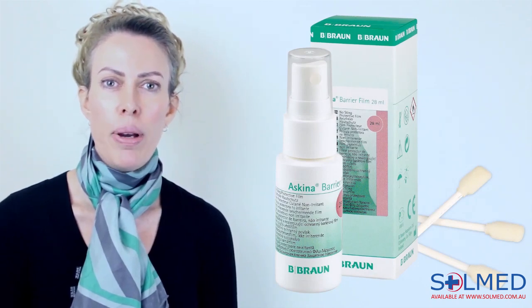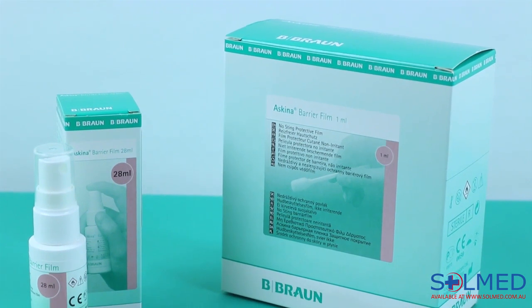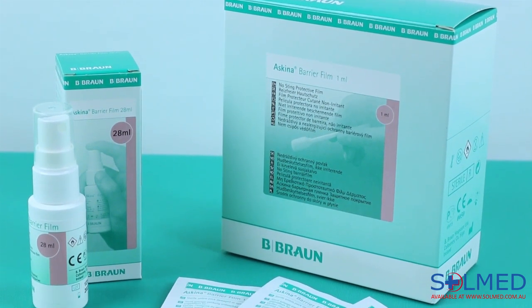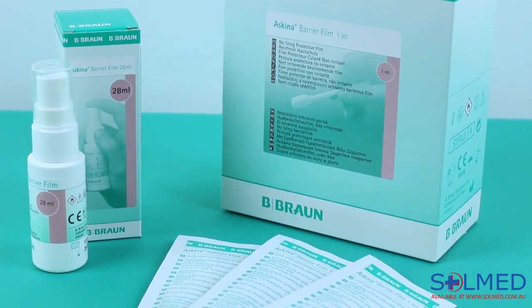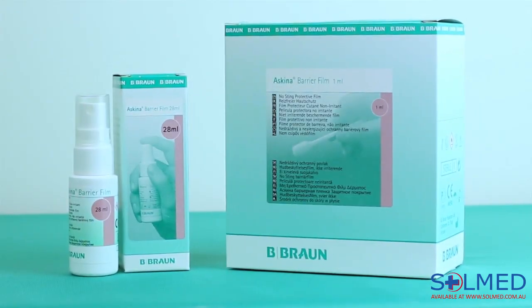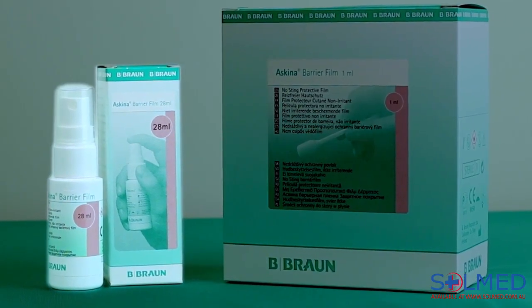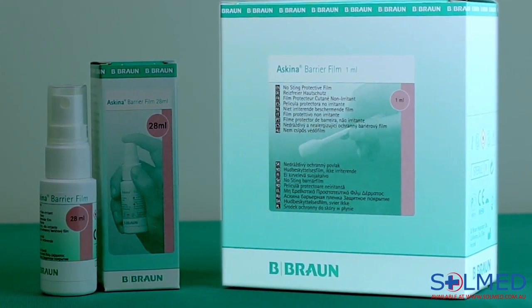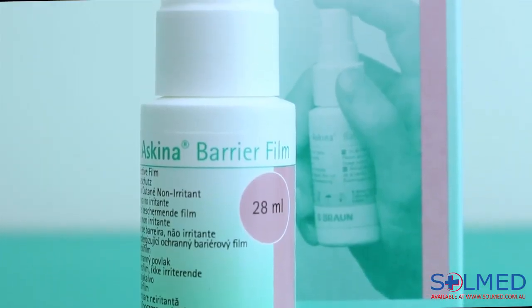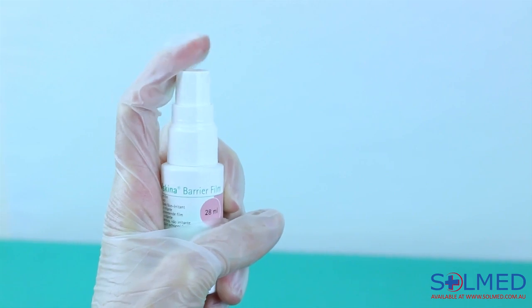This video will focus on Skeener Barrier Film, a rapid drying, alcohol free, transparent, breathable skin barrier that can be applied to intact or compromised skin. Skeener Barrier Film offers two different types of application: the first is a spray version and the second a swab version. The spray version comes in a 28ml bottle and averages 140 pumps.